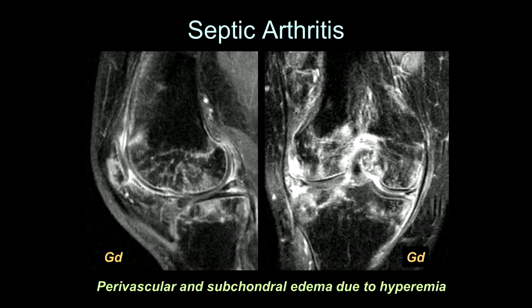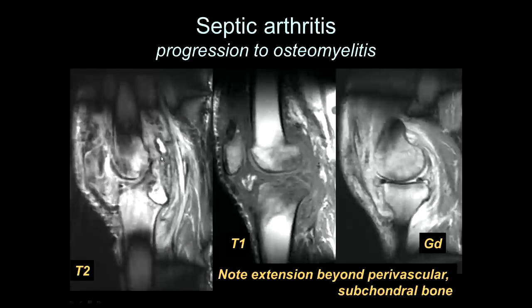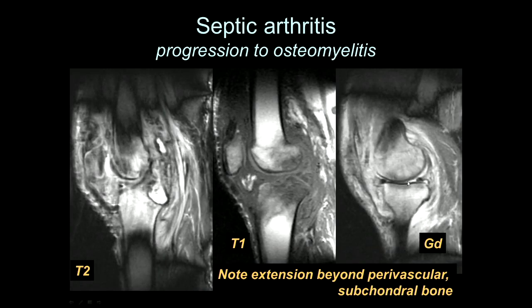As the septic arthritis becomes more established, you develop massive hyperemia. This is shown in this image of the knee with overflow of the blood vessels, leading to this perivascular edema pattern in the bone marrow — analogous to a heavy rainstorm with overflowing of a river. If the infection is allowed to progress, it eventually extends into the subchondral bone and the medullary space. You'll see replacement of T1 signal, bone marrow edema on fluid sequences, and contrast enhancement. At this stage, it's progressed to osteomyelitis.